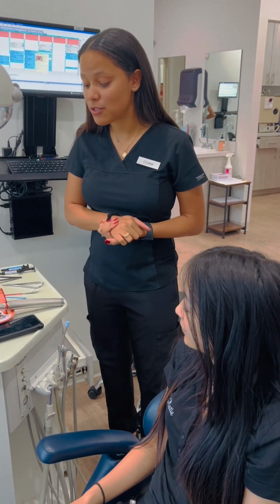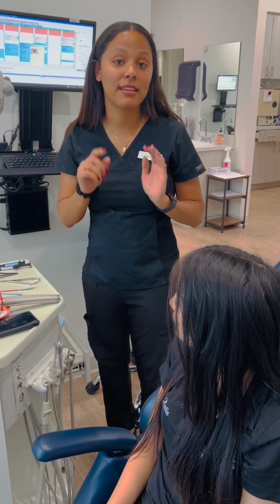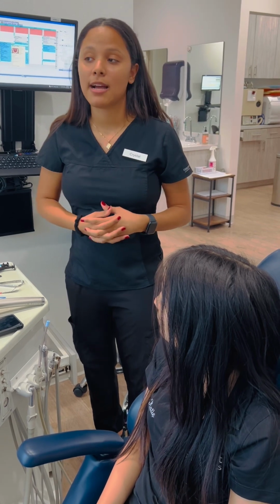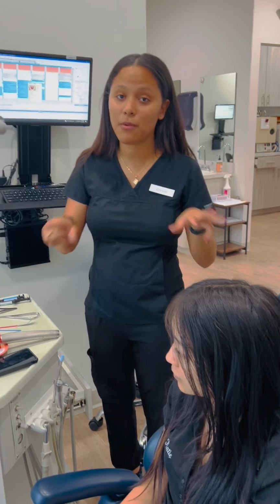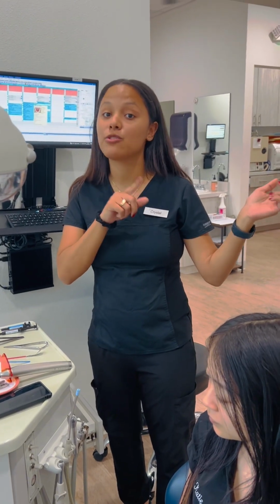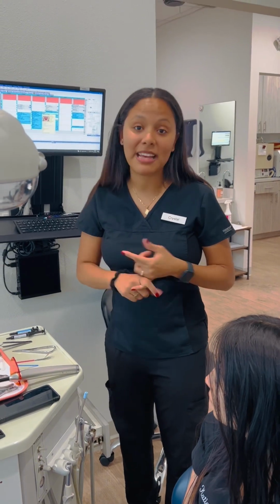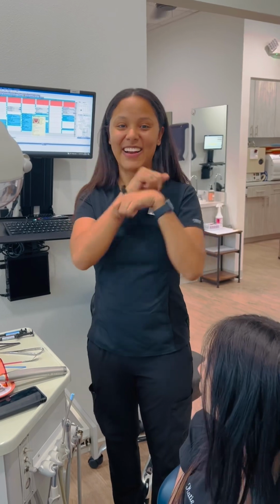So the first thing that we do at a start appointment is verify that the patient has a pano within a year. If the patient doesn't have a pano within a year, we need to take that pano. We also need to verify that the patient has photos, which usually in this office, they won't have from the consultation appointment. We usually take those initial records at the start appointment. So we'll be taking those today, and then we're going to go ahead and put the braces on.